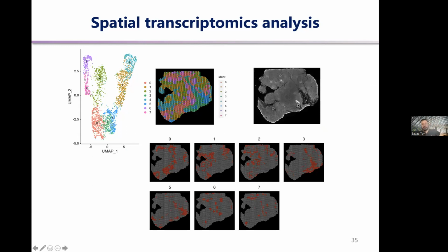And this is actual tonsil data. This is a specimen from human tonsil, a two-dimensional slice of tissue. When we analyze it with our spatial proximity ligation, we can observe these different regions that show the expression of different markers from T cells, B cells, dendritic cells, epithelial and endothelial cells, all in a spatial context. We can even observe the germinal centers in these tonsils. This is a very important immune tissue, and we are now getting proteomic data, both protein expression and protein complex expression, and mRNA expression from each spot in the tissue.